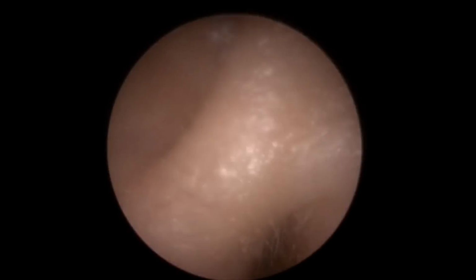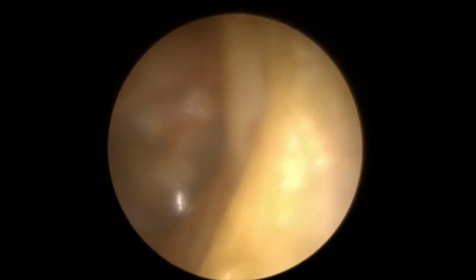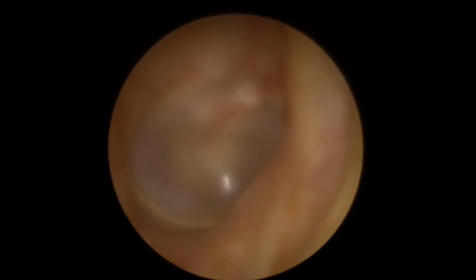Bit awkward because, as you can see, the suction will sometimes catch on the skin, which is very flexible and floppy here at the outer part of the ear canal. So it's trying to catch hold of the wax, but not the skin itself. There we are. There's the eardrum.